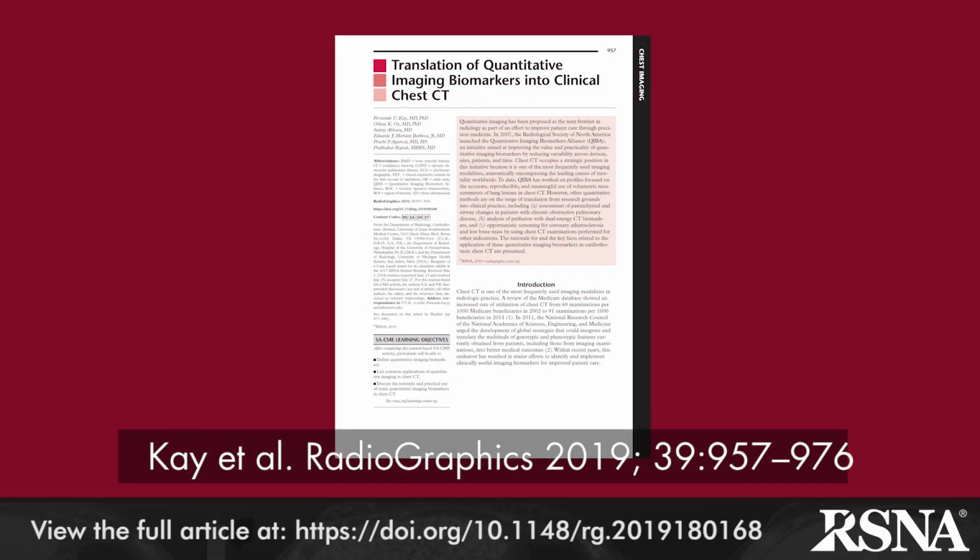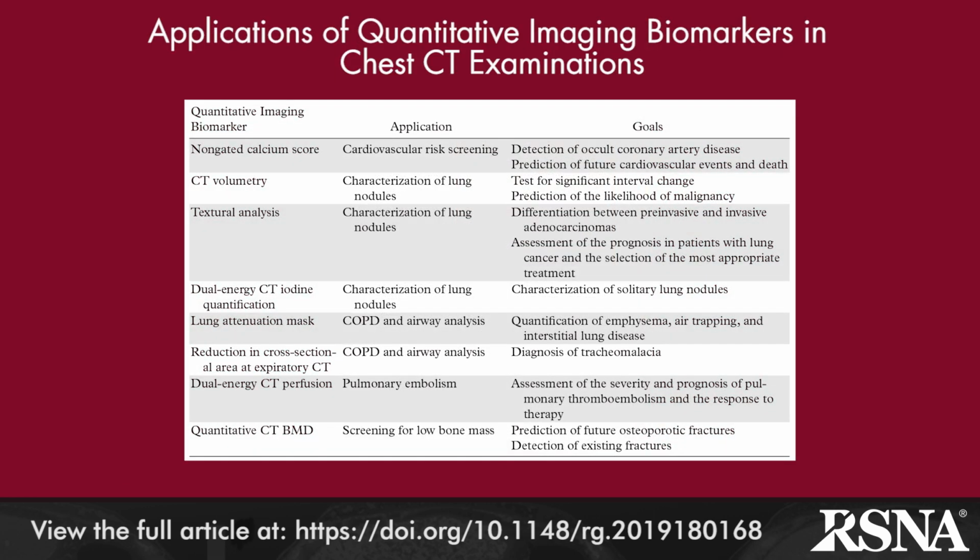This article explores the use of quantitative imaging biomarkers extracted from chest CT studies. The article begins by describing biomarkers as measurable objective characteristics derived from images that can be used to assess normal biologic or pathologic processes, or a response to a therapeutic intervention.